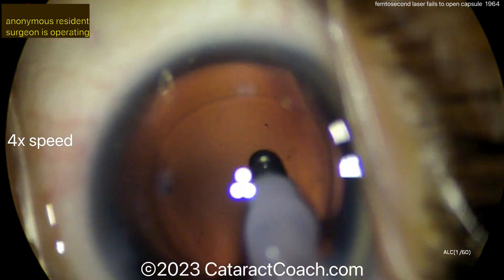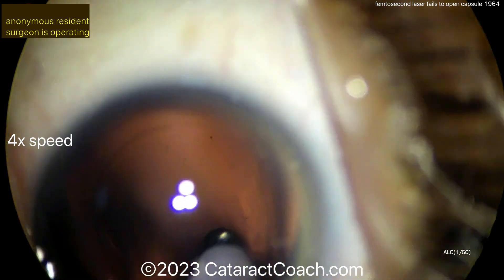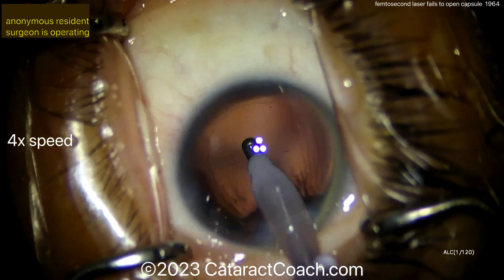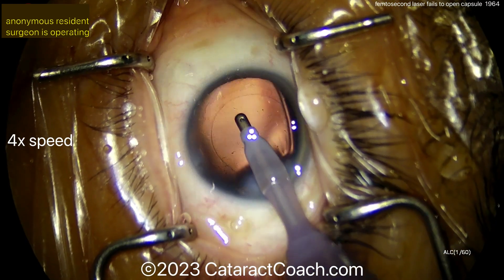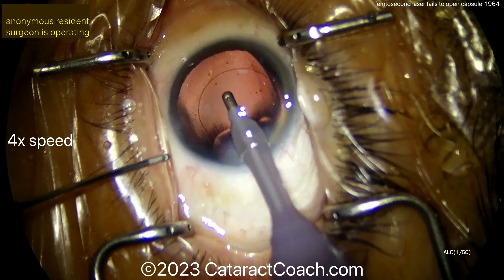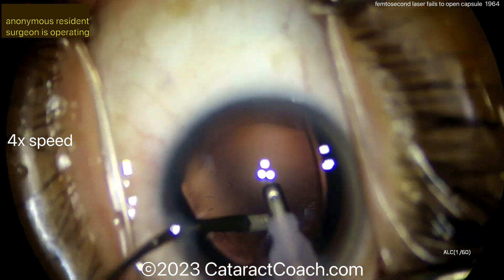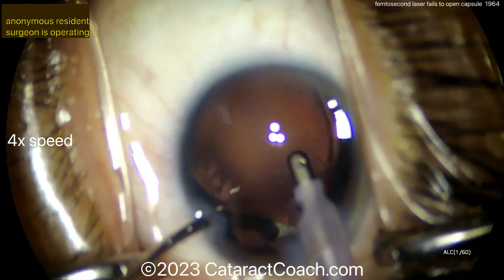You certainly don't want that situation. Cleaning up the capsule bag very nicely here. At the end I want to show you the case conclusion so you can judge: is this a sufficiently large rhexis? We're going to put in an optic with a six-millimeter diameter. Here it is — end of the case, capsule bag looks nice and clean, everything was great. I would not go too crazy on the capsule polishing here. There appears to be some sub-incisional lens material — do you see that?